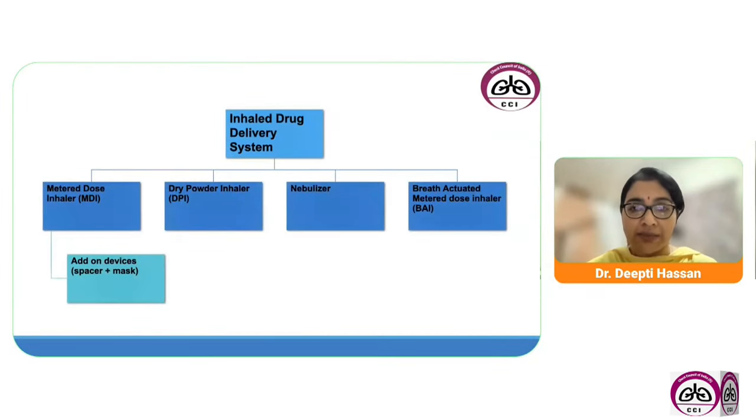So what are the systems available? We have meter dose inhaler with an add-on device of a spacer or a mask, a dry powder inhaler, nebulizer, and breath actuated meter dose inhalers. So the nebulizer part will be covered by Dr.